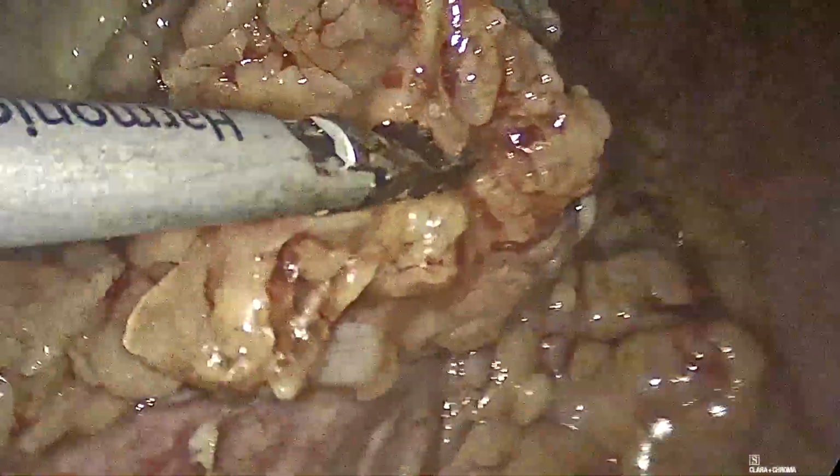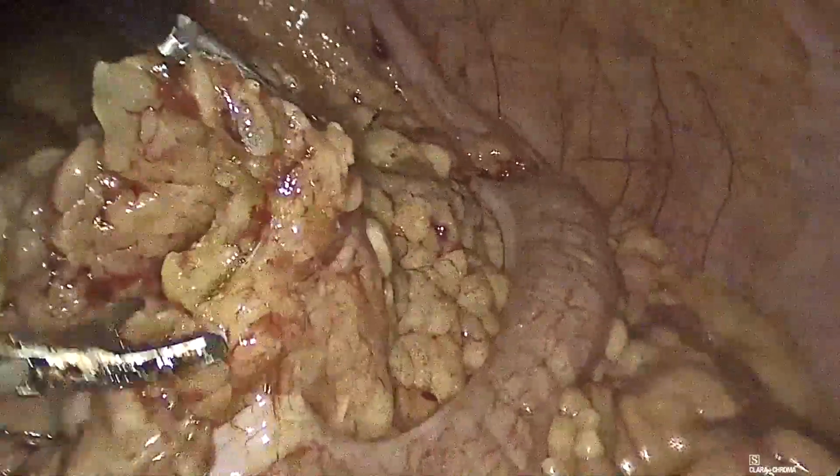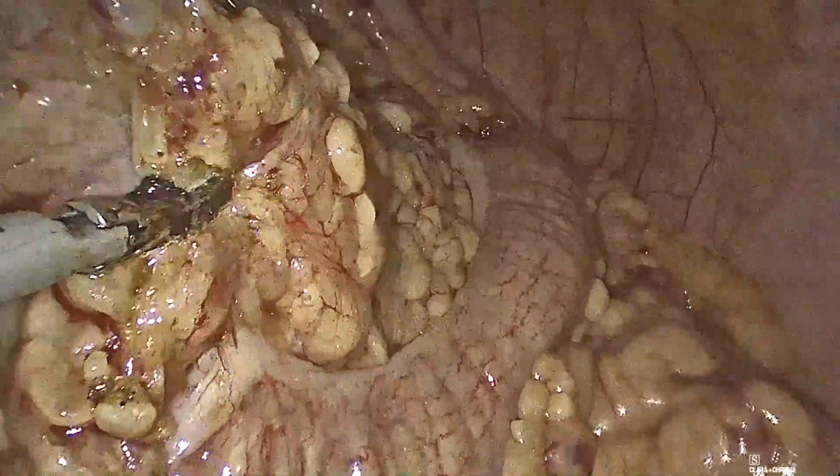Supracolic mobilization was initiated by mobilizing the transverse colon. Therefore, contribution of these three approaches was directed to mobilize the splenic flexure and thus completing the left hemicolon mobilization.